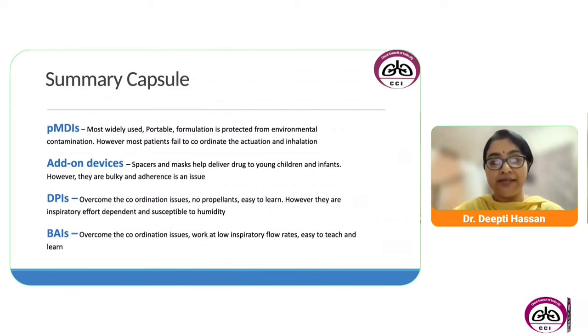So let me summarize. The MDI is what is most widely used. The formulation is protected from environmental contamination, but most patients fail to coordinate the actuation and inhalation. That is why there are add-on devices like spacers and masks, which help to deliver the drug to young infants and children, but they are bulky and adherence is the issue.